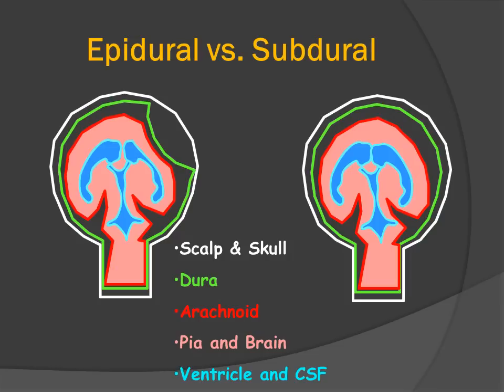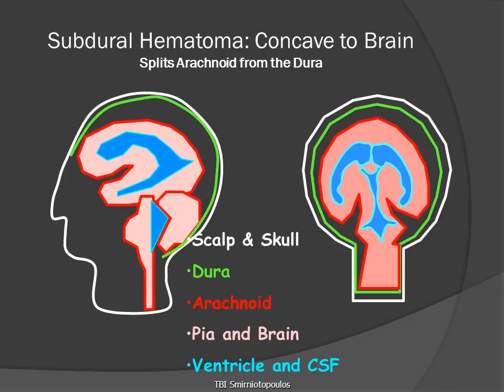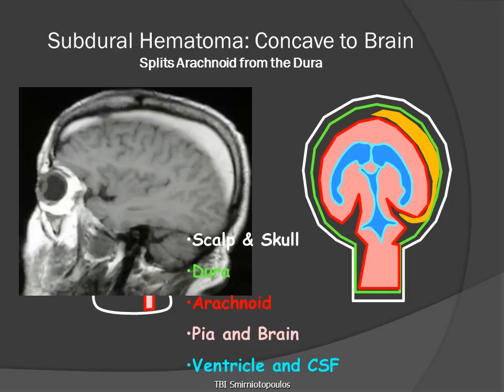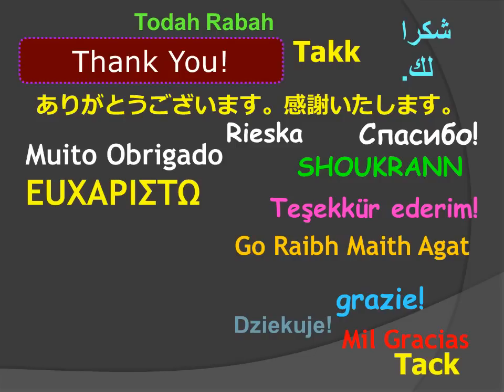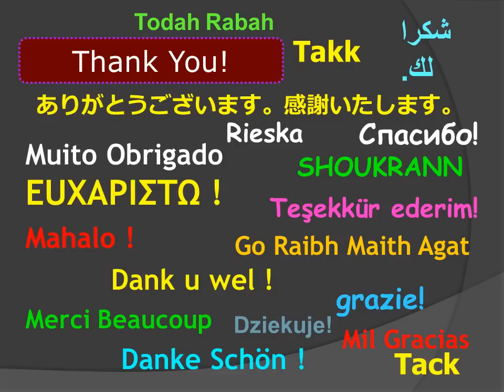In comparing epidural and subdural hematomas: epidurals are biconvex, while subdurals are classically concave towards the brain. When we have a subdural hematoma, the blood layers around the arachnoid membrane and underneath the dura, and may even go underneath the occipital lobe and underneath the temporal lobe. Again, the collection is typically concave towards the brain. This has been another MedPix video. Thank you for your kind attention.